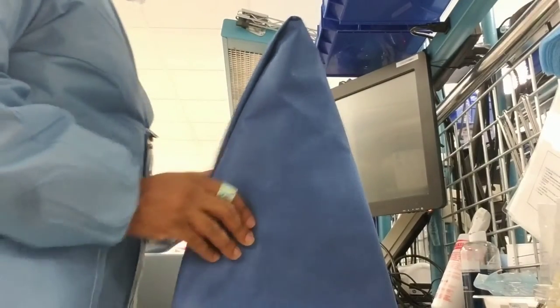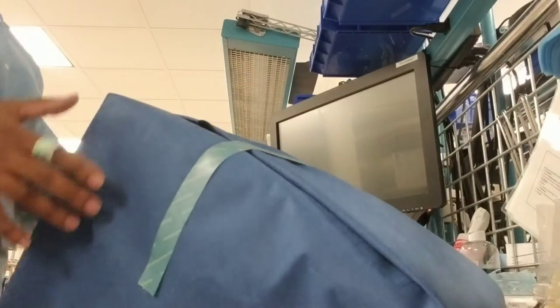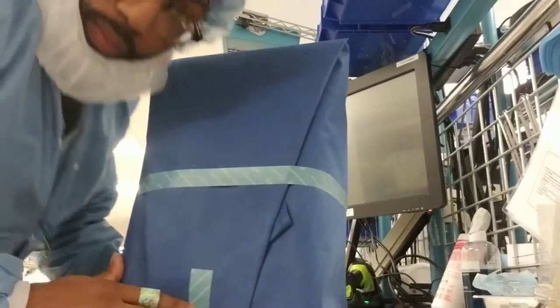So, you know, guys, like once again, the triangle, the hardest item to wrap in the sterile processing department. And as you see, I tape it across. And there you go. Look at this. Look at this. Only I can do that.